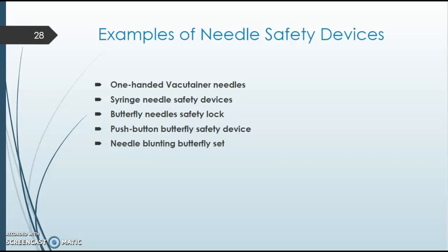The safety devices, again, I'll show you in laboratory, but very important that you immediately click the safety. Butterflies have a needle safety lock, and so it's just a slightly different process as far as putting the safety on, but very easy. Again, that's your first thing after a draw. There's also a push button butterfly safety device. You typically don't use those as frequently, but I will show you these needles as well.